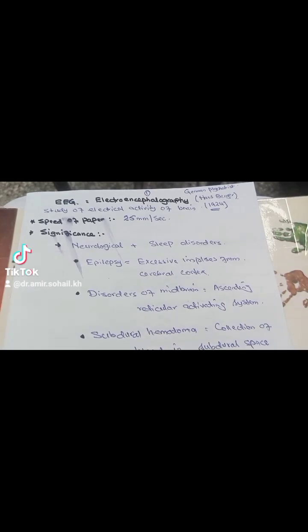Dear colleagues, today we will discuss EEG. EEG is the abbreviation of electroencephalography. This investigation was used for the first time by a German psychiatrist, Hans Berger, in 1924. It basically measures the electrical activity of the brain, especially the cerebral cortex.